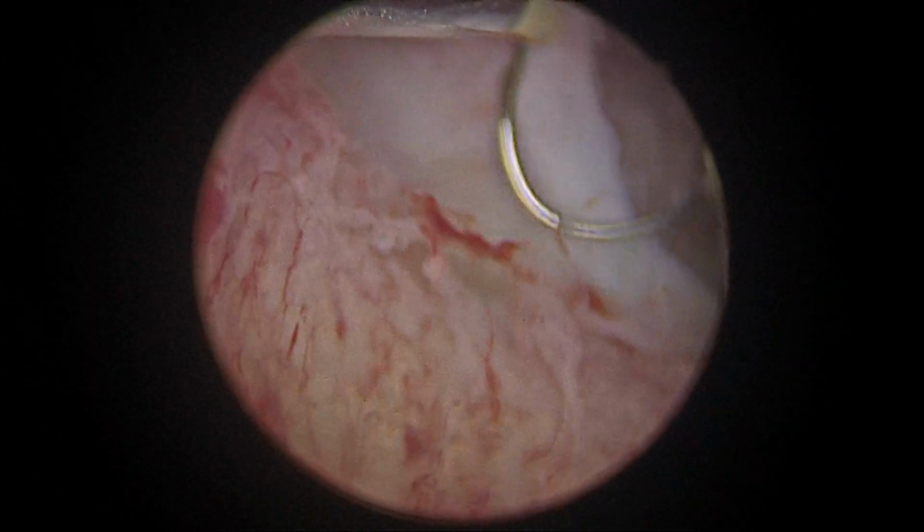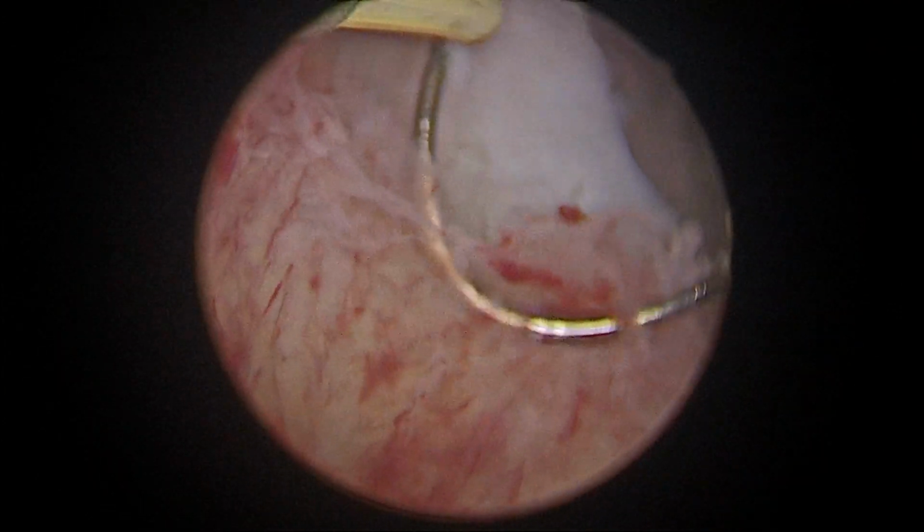the uterine massage. After doing uterine massage, we can see this type 2 myoma become almost like a type 1 myoma. That means less than 50% is in the myometrium. So it has come to the mucosa, submucosa popping into the uterine cavity. Now it becomes easy to remove the myoma. It was not possible in the beginning.